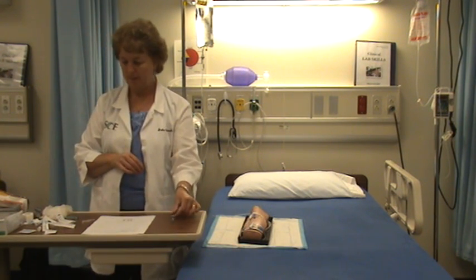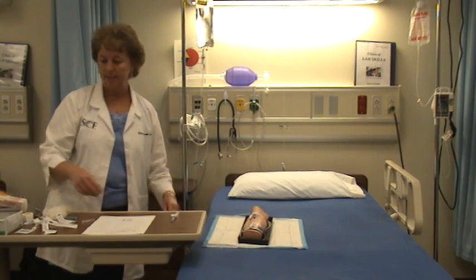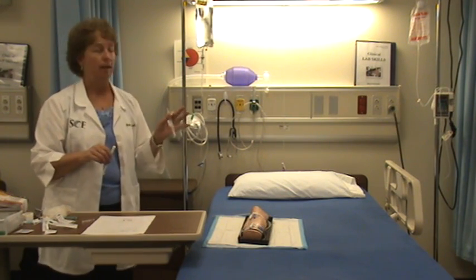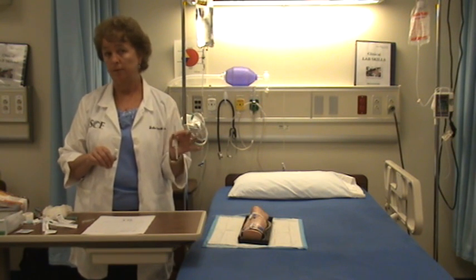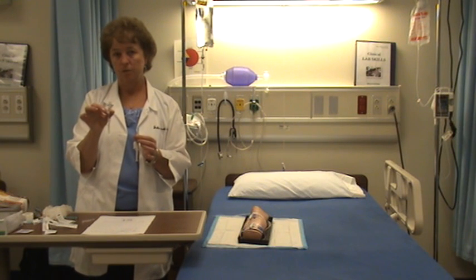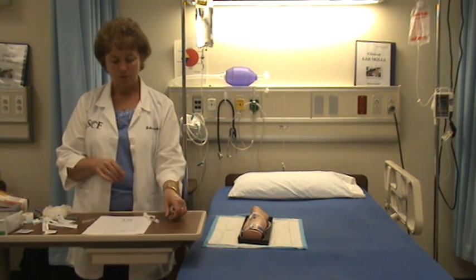I have my Lasix 20 milligrams and the patient has a running IV. The only other thing I need is a post flush. I check to see if Lasix is compatible with potassium — it is — and it's half normal saline, which is also compatible with Lasix. So I don't need to do a pre-flush or stop the IV for incompatibility issues, but I do need a post flush to flush the Lasix through the rest of the IV line before I leave the room.